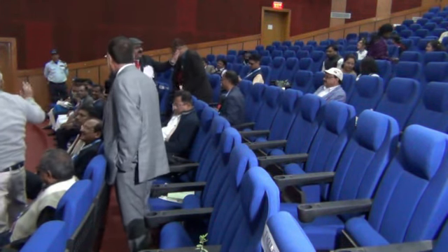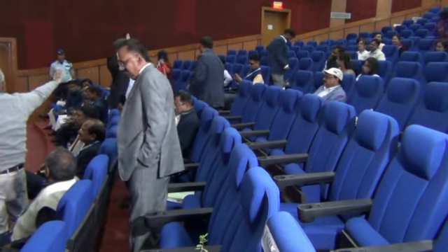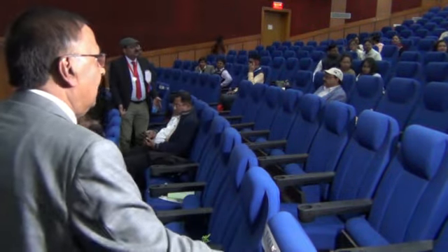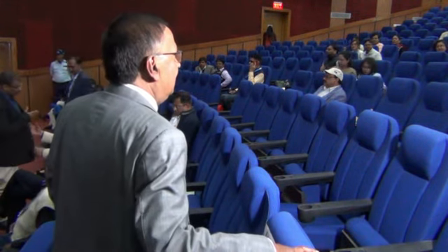एक सिंपल सी चीज है, आप सीरम क्रिएटिनिन चला रहे हैं, उसके काइनेटिक ग्राफ में एक नॉच आ गया, आपके टेक्नीशियन को कुछ समझ में नहीं आएगा, वही रिपोर्ट दे देगा। एक टेक्नीशियन को पता है कि लिक्विड केमिस्ट्री में क्रिएटिनिन में एवरी डे कंट्रोल रन करना है, नॉट एक दिन का लेकर चला देगा। I would say every batch, sir, every day it has to be calibrated and controlled। रिपोर्ट किससे पूछा रहा है?